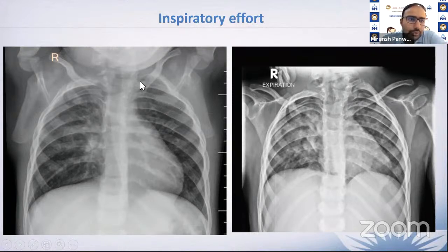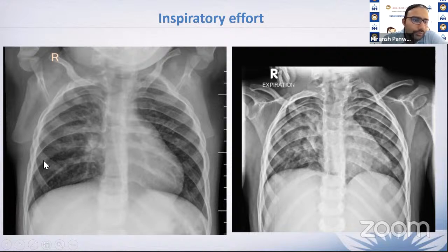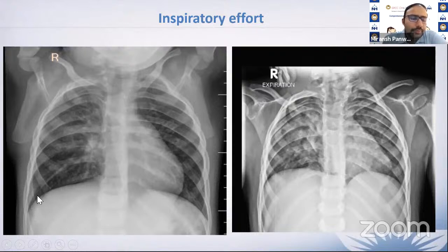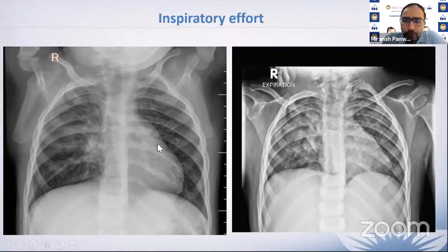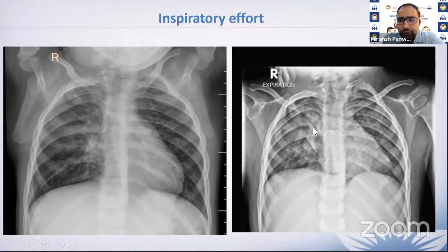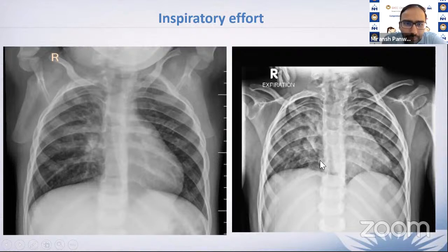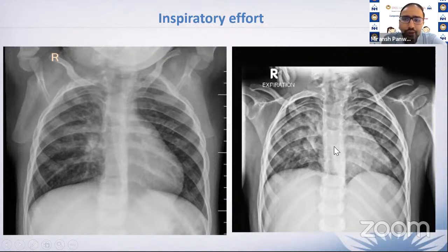Regarding inspiratory effort: a properly inspired X-ray should show at least six anterior ribs covering the lung fields, with the sixth rib touching the dome of the diaphragm. If the same patient is imaged on expiration, there is a gross difference — the lung fields are significantly hazier and there is an apparent cardiomegaly appearance. These confounding factors on an expiratory film can give a wrong diagnosis. Always assess whether inspiration is adequate before giving any diagnosis with certainty.